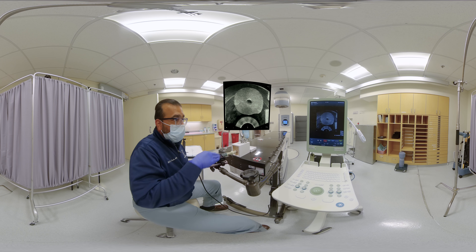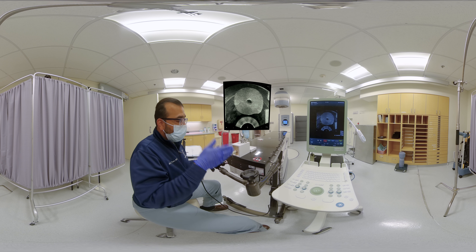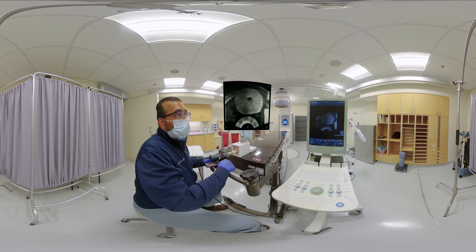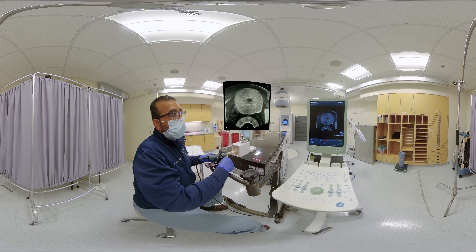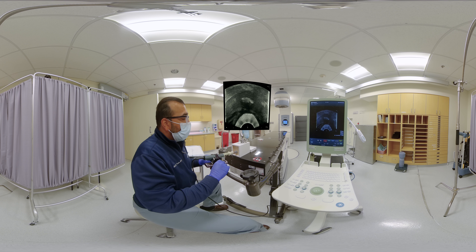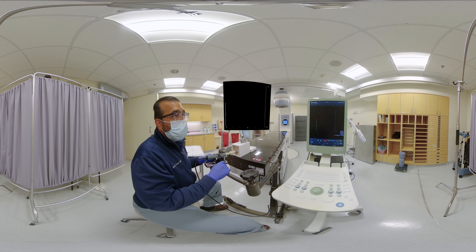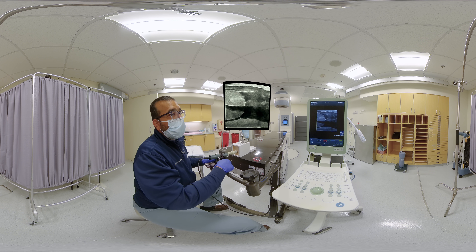We're at optimal placement, roughly parallel to the floor on the midline urethra. Probes that are off the midline of the patient's prostate gland will not scroll through the gland entirely. We use the term 'stepping in' or 'step cranially' to go towards the prostate base. We use the term 'stepping out' or 'step caudally' towards the prostate apex. Let's switch to the sagittal view of the prostate gland. The sagittal crystal on a biplane transrectal probe is located caudal to the axial crystal, so you must step in to view the entire gland.